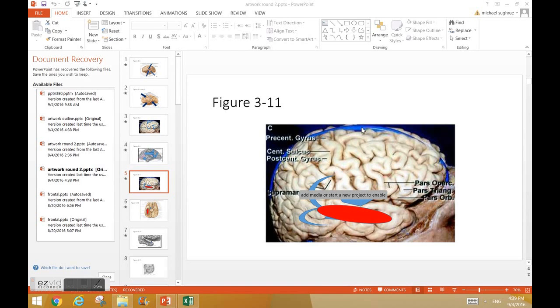These two videos show resection of tumors from the motor cortex. The first one is an anterior tumor. You can see that it's invading the motor strip, which I outlined right about here. And what we're going to do is stimulate very carefully.